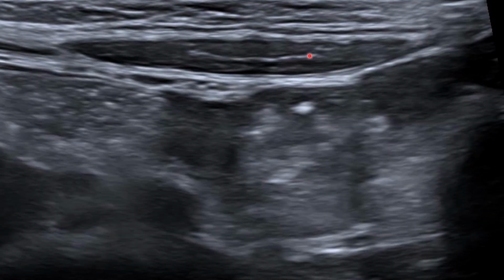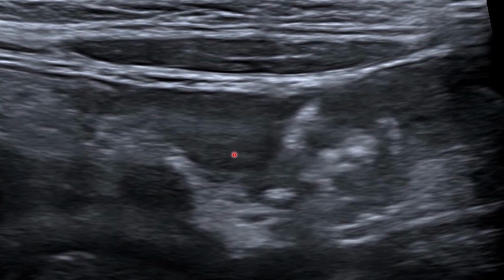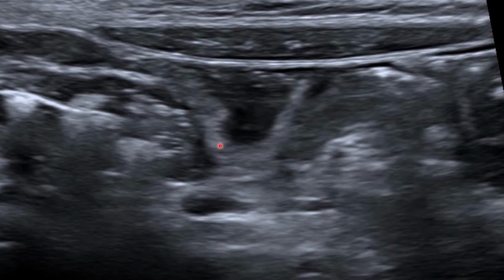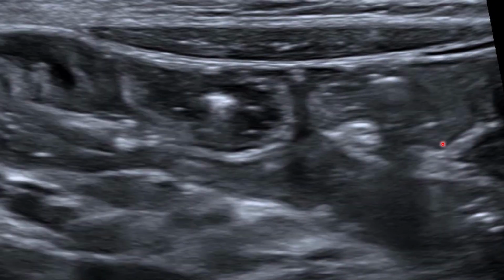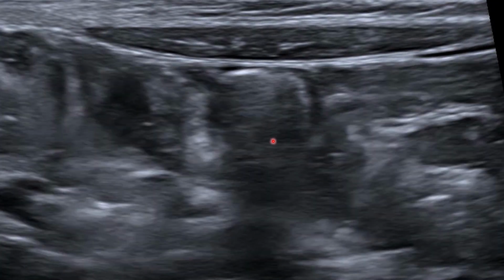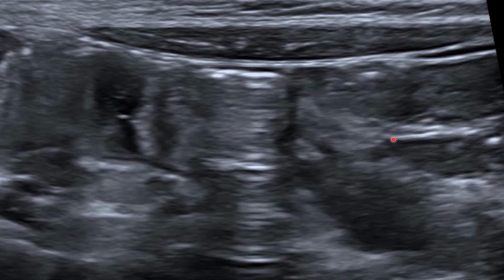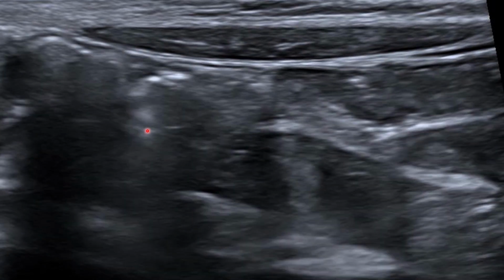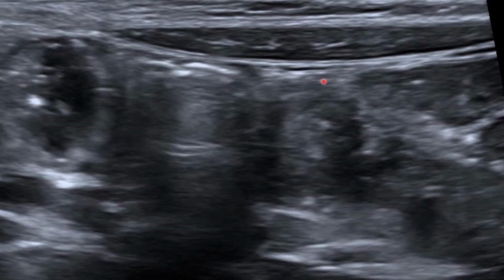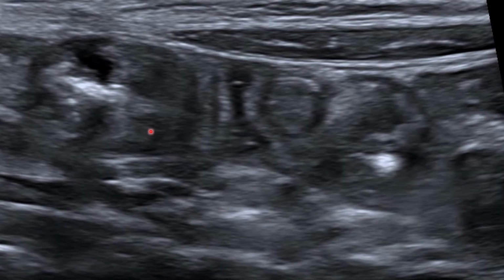So here you can see the stomach there, and you can see the bowel movement there, bowel movement there. You can see what is going on. So this is the internal milieu. This is the inside of a 14-year-old girl, and then they were suspecting intussusception, but you can see that there's nice bowel movement there. Look at that, this is a nice bowel movement.